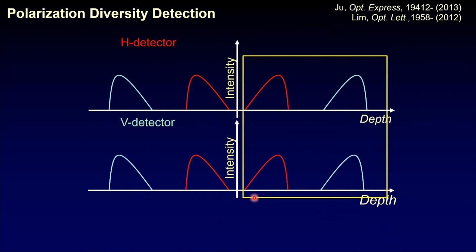This combination, this combination, and this combination are associated with a different detection or output polarization. And this combination and this combination are associated with different incident polarization, right? So it's a combination of 2 incident polarizations and 2 output polarizations. 2 by 2, it becomes 4.